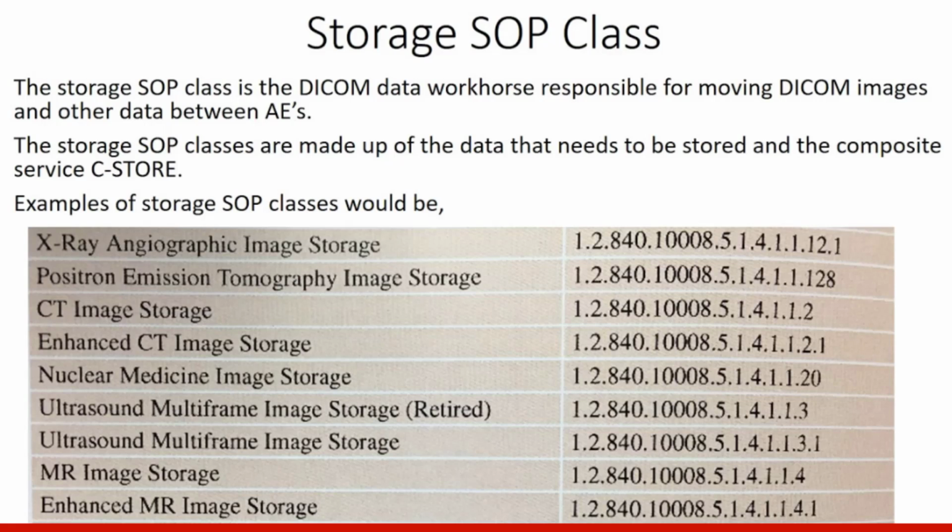It is responsible for moving DICOM images and other data between applications. The storage SOP classes are made up of the data that needs to be stored and the composite service C-store. Let's take a look at some of the examples. For example, nuclear medicine, ultrasound, MR, and X-ray.